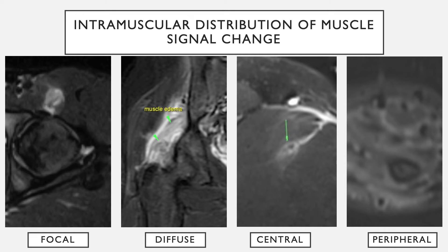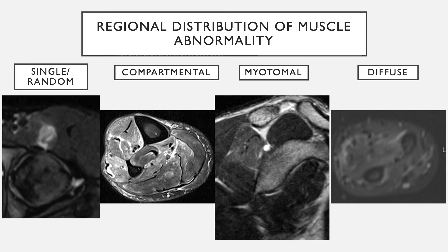Thinking about intramuscular distribution: we can have focal abnormality or diffuse muscle edema involving the entire muscle. We can have it centrally located along the myotendinous junction in a long muscle, or peripherally located along the fascial planes. For regional distribution, it can involve a single or random muscle, a compartment — for example, mainly the peroneal compartment with the posterior compartment spared — or it can be myotomal, as in a ganglion cyst in the spinoglenoid notch where the supraspinatus is spared and only the infraspinatus shows edema. Or it can diffusely involve all muscles.